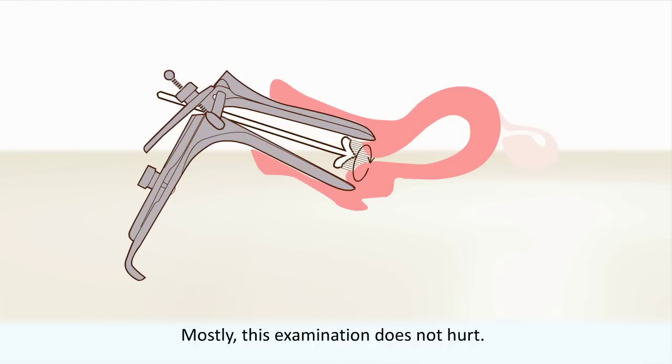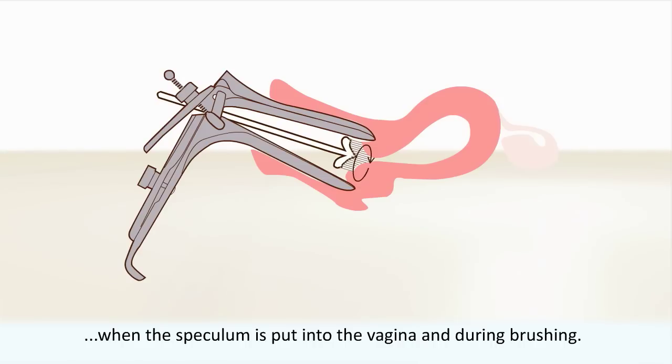Mostly this examination does not hurt. You can have a slight sickly feeling when the speculum is put into the vagina and during brushing.